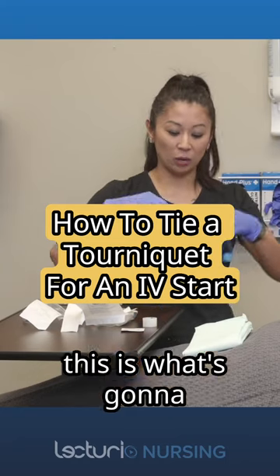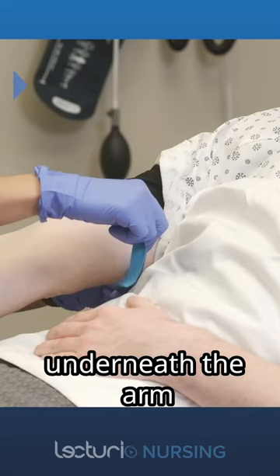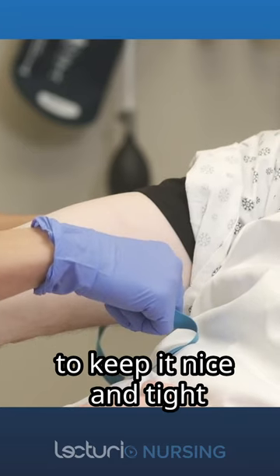Next I'm going to apply the tourniquet. This is what's going to help apply pressure to the arm. We're going to go underneath the arm. The closer that you put it towards the patient's arm, it makes it much easier to keep it nice and tight.